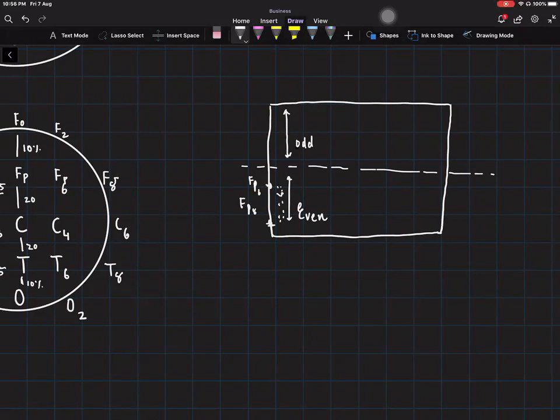So if you see any inconsistency, a major increase in the amplitude, or a major increase in the frequency, essentially you'll have vertical lines on the EEG, and these lines denote a gap of 1 second.